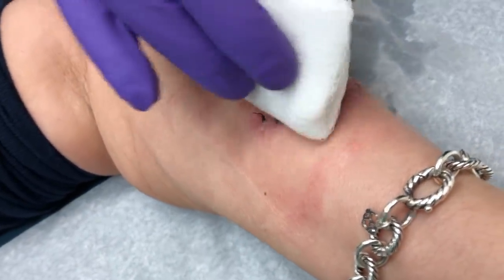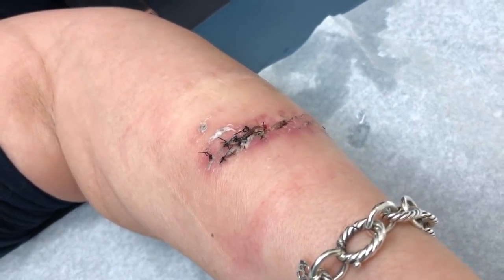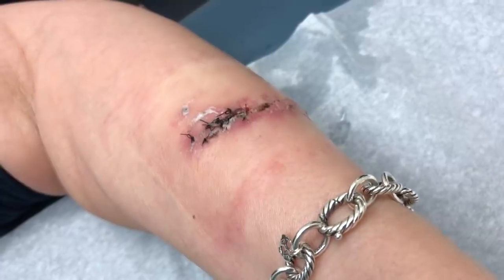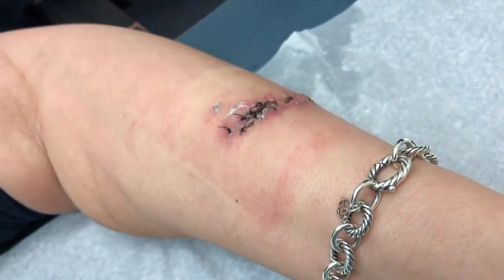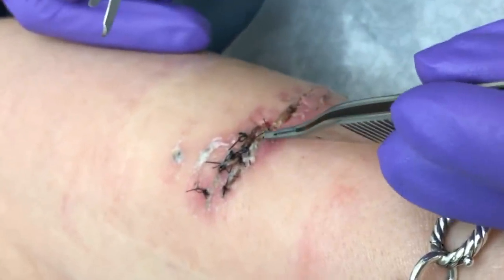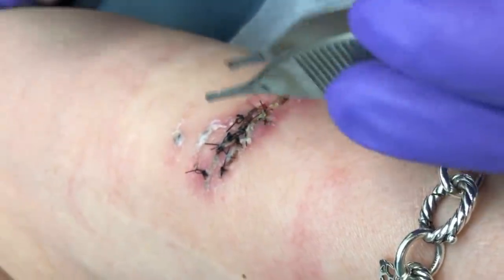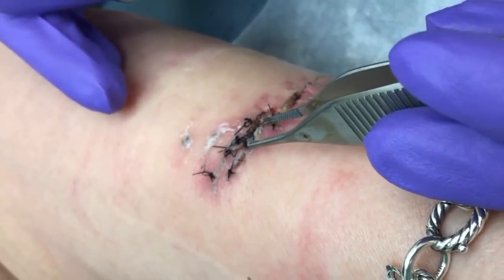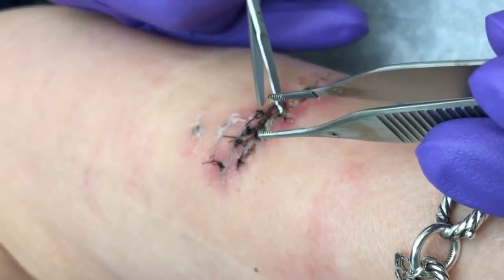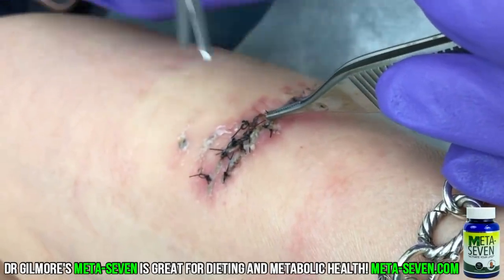It should be good and soft. Yeah, okay — it still kind of looks nasty. Well, it's only been a week. Make sure I don't run over your toes. She's made of stone anyway — Maidstone. Those look like little hairs. I think those were fours — she had to use four-oh suture because of the wound; she kept having to open up another pack.